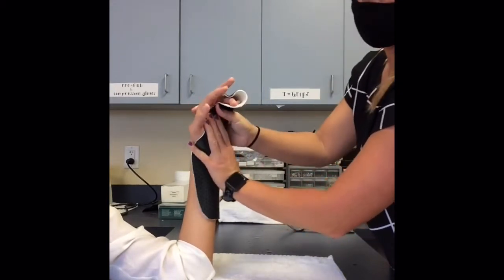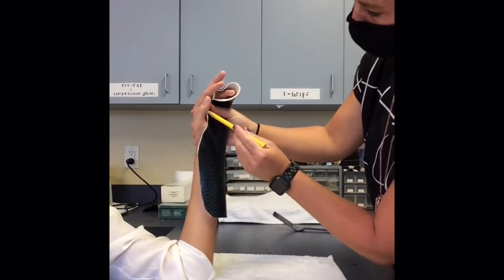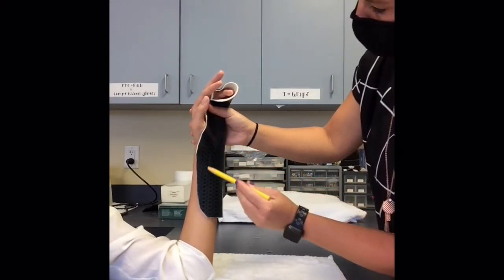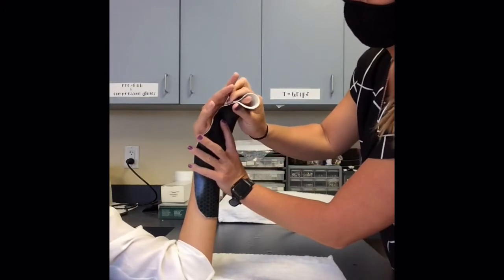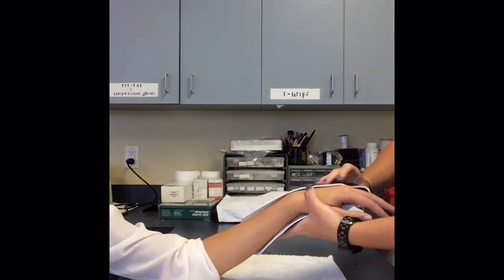Once the thermoplastic is dry, you can use a pencil to mark where you want to make your adjustments, remembering that the long finger needs to be cleared dorsally and volarly. Put it back into the hot water to adjust the orthosis as needed.